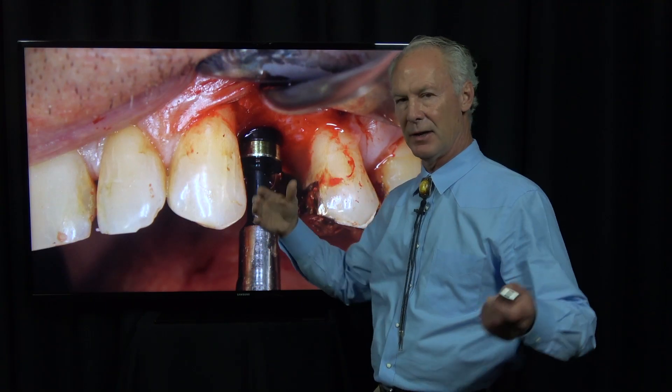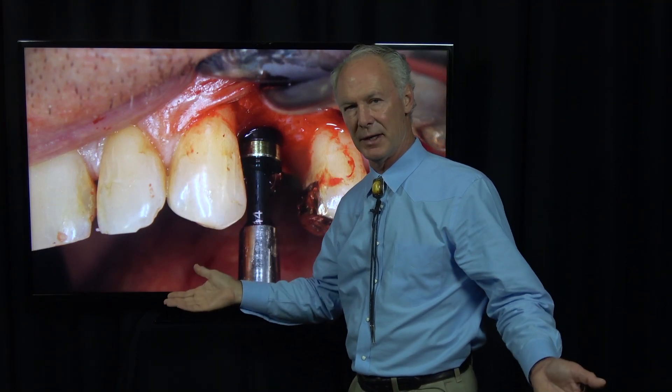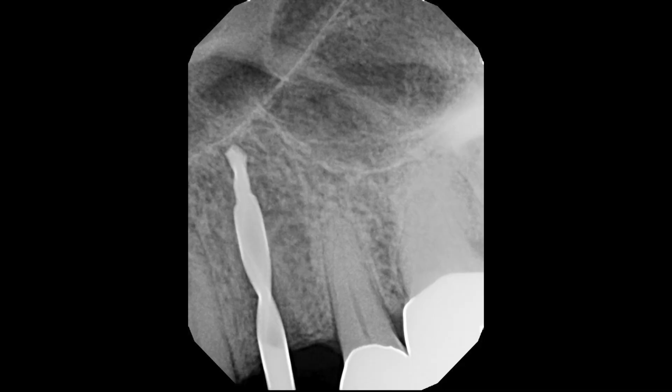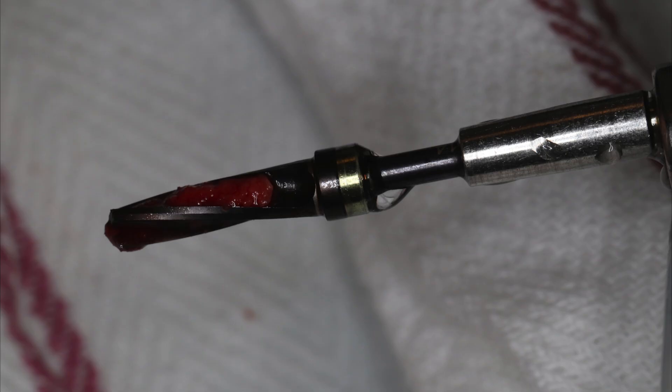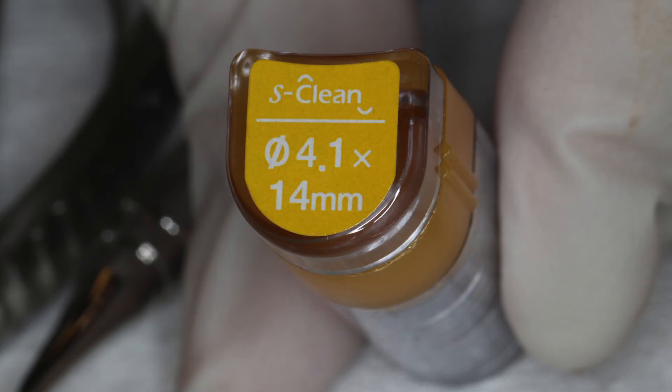It's ingenious, but you'd think they'd all do this. I don't know what other implant systems are thinking by not having a shoulder on the drill. We take this radiograph to ensure it's right. We're at 4.1.